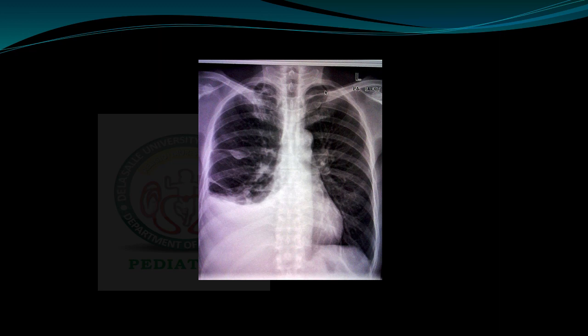If you see fluid after the chest X-ray is taken on the lateral decubitus, then it is secondary to a pleural effusion. But if that white mass remains, it could be a mass in the lower lung. Also, you correlate it with your PE findings: when you do your percussion, it is dull on the lower lung and there is decreased breath sounds on the lower lung.